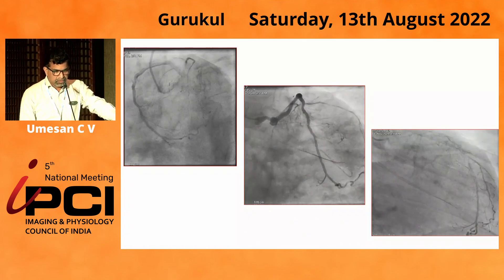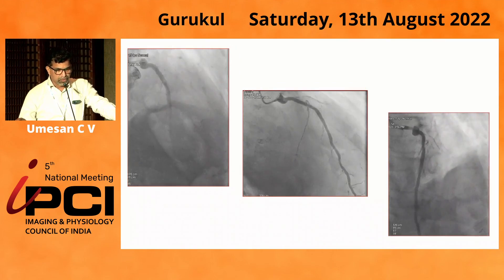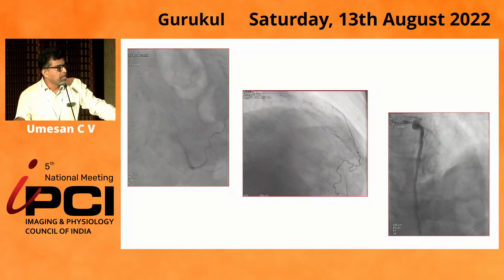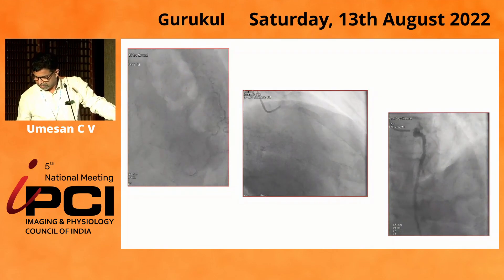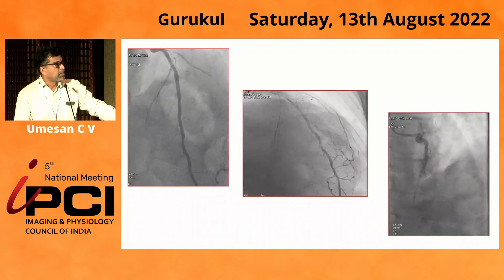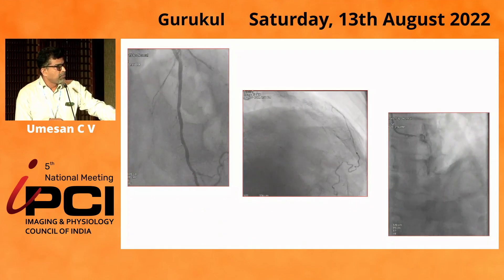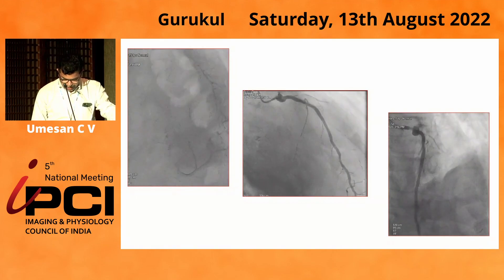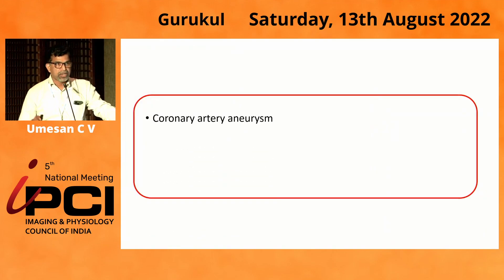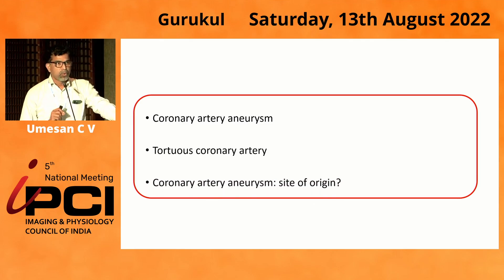The discussion is about the lesion in the proximal left coronary system. In the caudal views, if you look closely, you can see the left main and some narrowing with a bulge in the distal left main. There is a superimposed vessel flowing down that bulged area. So are we dealing with a coronary artery aneurysm, or is it simply a tortuous coronary artery? And if it is a coronary artery aneurysm, what is the site of origin?